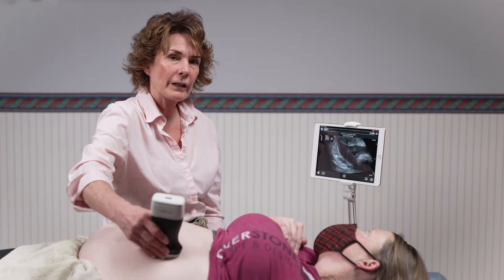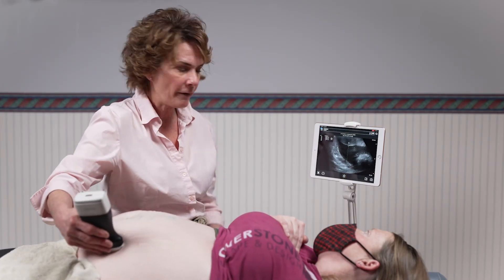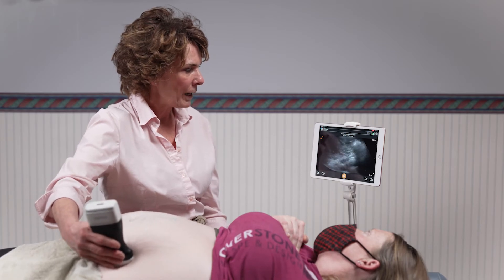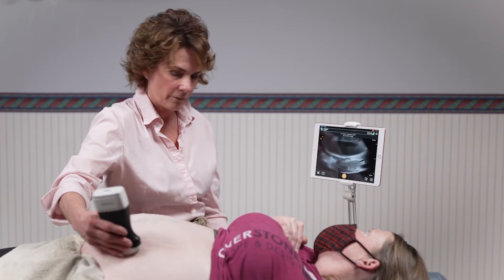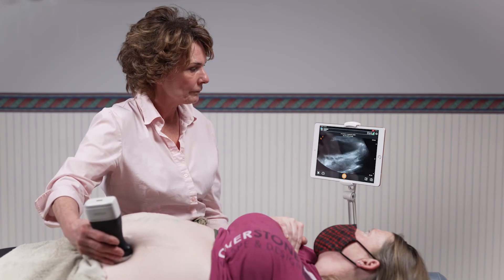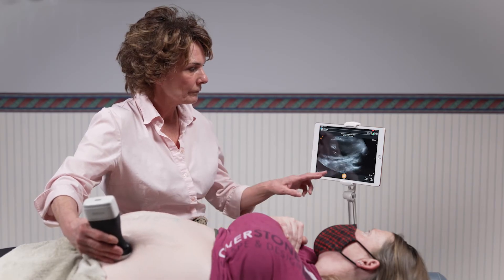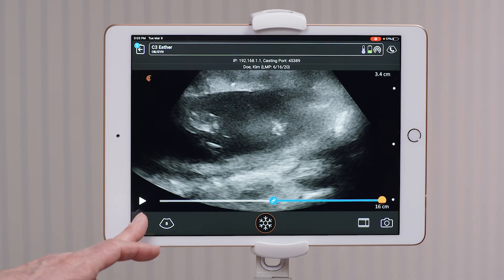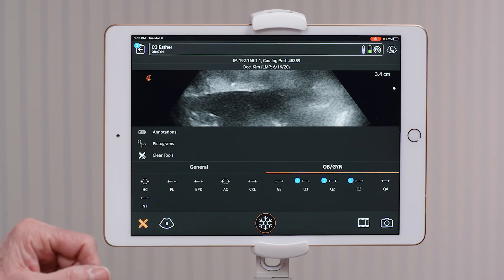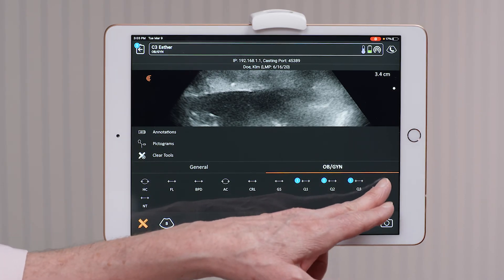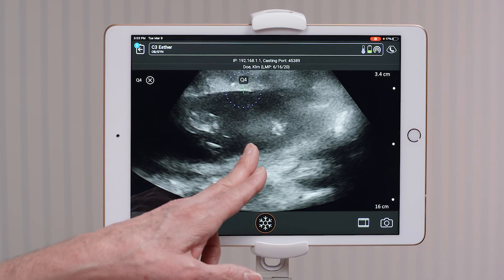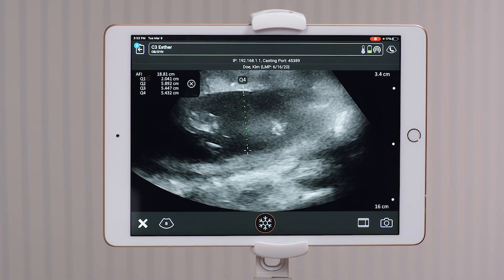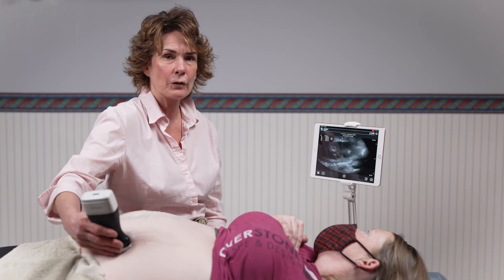Now for the last quadrant, I move down to the left lower quadrant, find my pocket of fluid, freeze the image, go to my measurement tools in the bottom left-hand side, select quadrant four, perform my measurement, and now you can see the AFI in the left upper-hand corner.